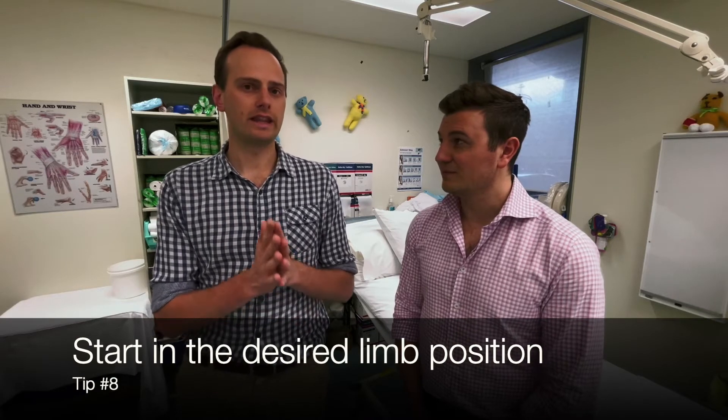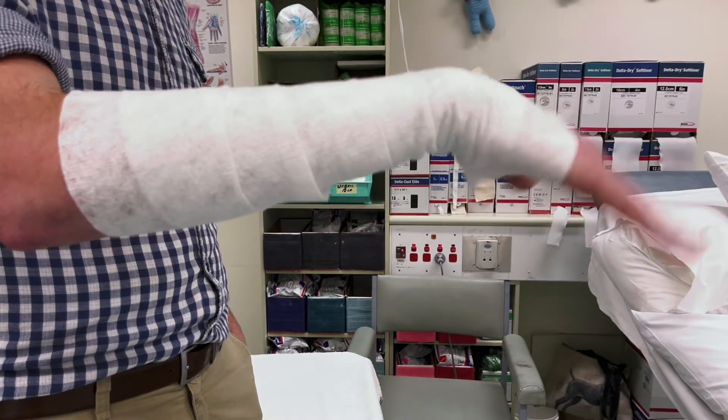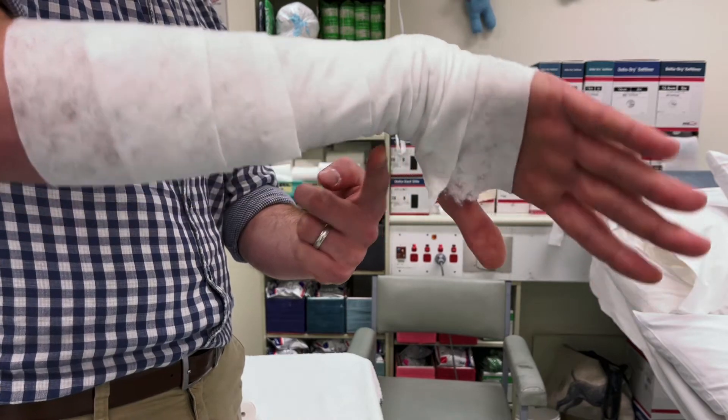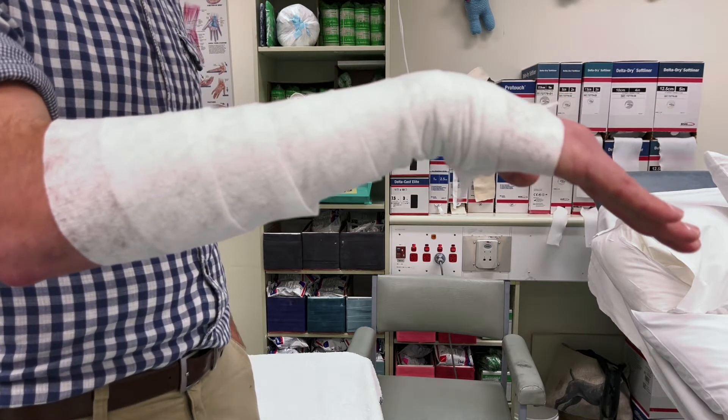For positioning, the most important thing is to put the limb in the position you want it to be at the end of casting before you even start putting padding on, and keep it there throughout. If the limb is in a different position during application, when you do your molding or bend the wrist you'll get ripples or big indentations developing on the underside. Put the foot or the hand where you want it at the end before you start — even before applying padding.